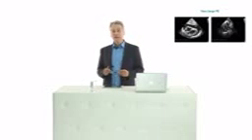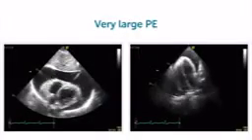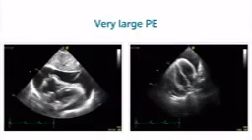And one last topic, if you have a very, very large pericardial effusion, as the swinging heart that I showed you previously, most likely the patients will have at least some degree of dyspnea or some symptoms. Not necessarily tamponade, but they will be symptomatic. And frequently you will have to act, especially if an effusion is as large as this one here.